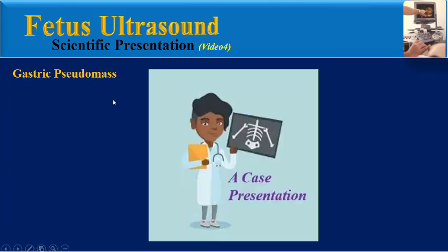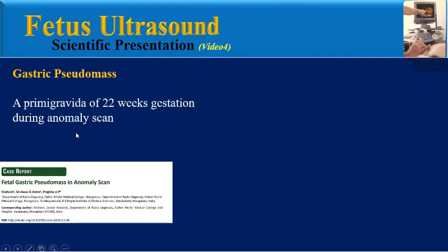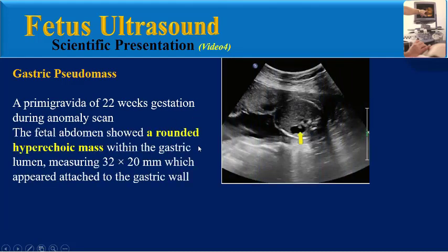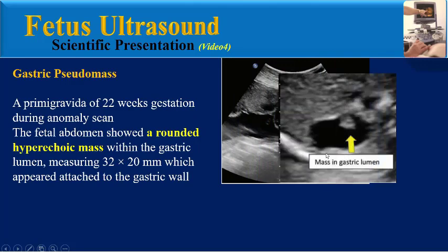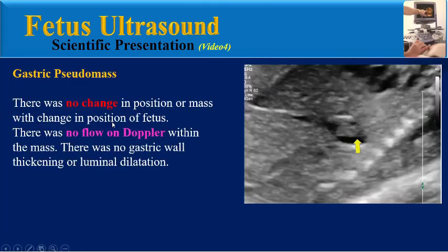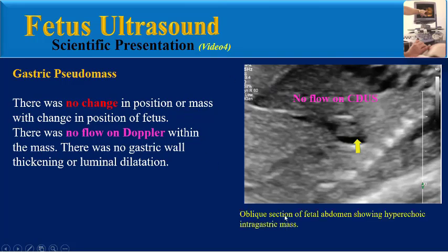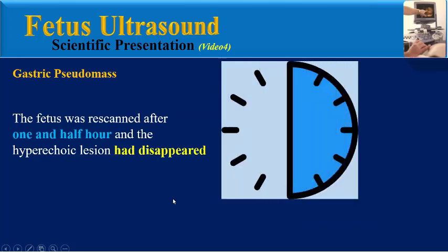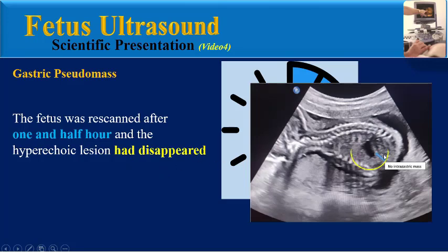We will review two teaching cases together. The first case: a primigravida of 22 weeks gestation during an anomaly scan. The fetal abdomen showed a rounded hyperechoic mass within the gastric lumen which appeared attached to the gastric wall. There was no change in position of the mass with change in position of the fetus. There was no flow on color Doppler ultrasound within the mass, and there was no gastric wall thickening or luminal dilatation. As we can see in this oblique section of fetal abdomen, a hyperechoic intragastric mass without any change in position. The fetus was re-scanned after one and a half hours and the hyperechoic lesion had disappeared.